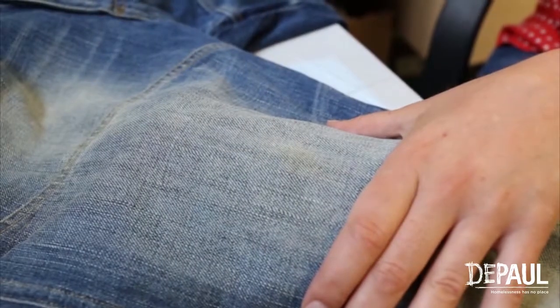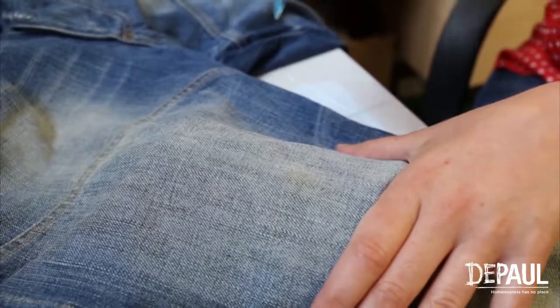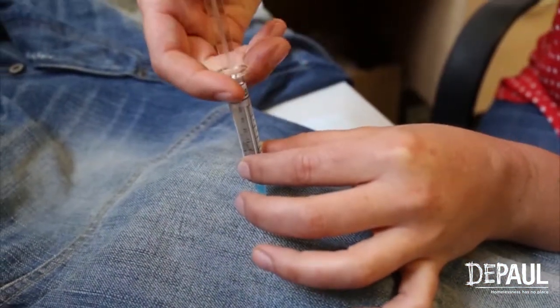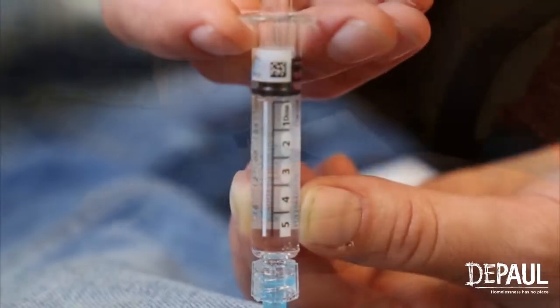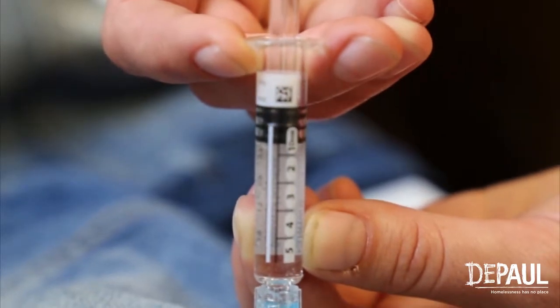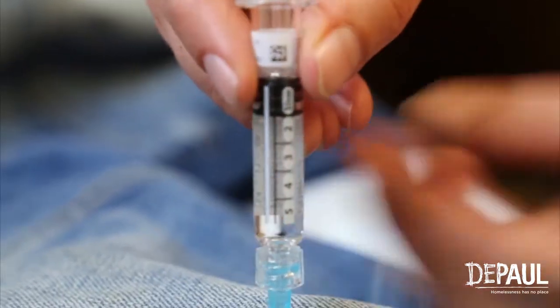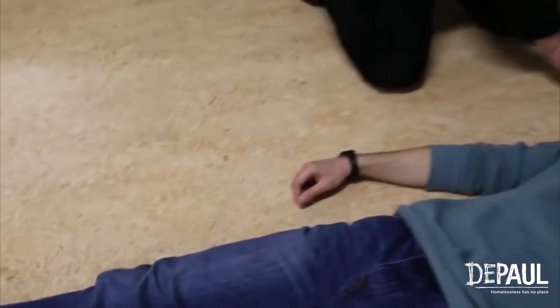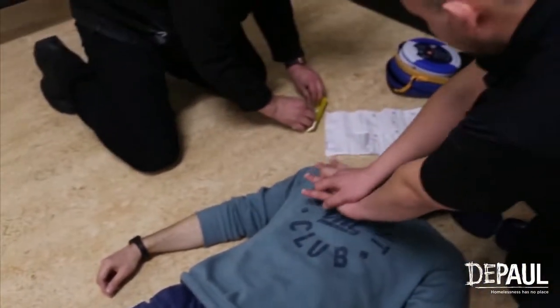Remove the rubber cap of the naloxone syringe and attach the needle in a twisting motion. Hold the naloxone firmly at the barrel and at the tip of the needle sheath. Remove the needle sheath, being careful to keep your fingers away. Administer one dose of naloxone in the largest part of the leg at a 90 degree angle, holding the device like a pen or a dart. Inject the naloxone slowly into the first black line. Place the used naloxone back into the yellow tray, being careful not to touch off anything.